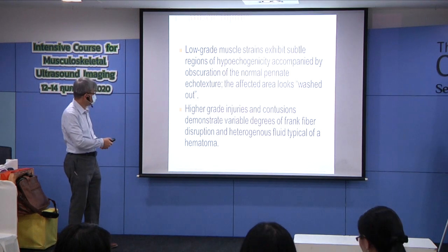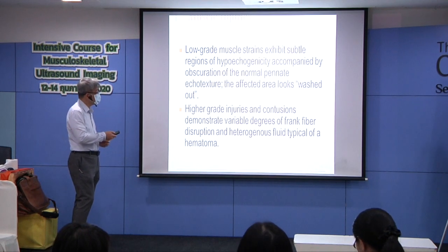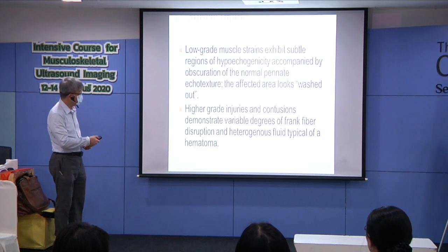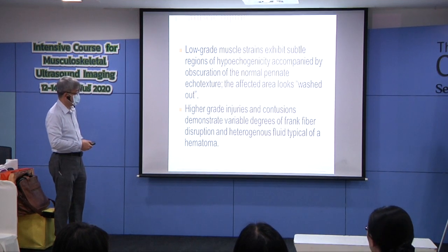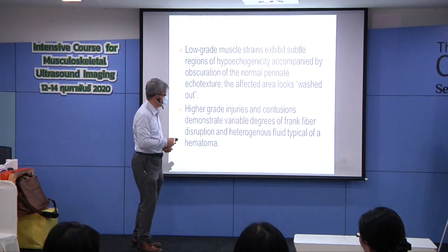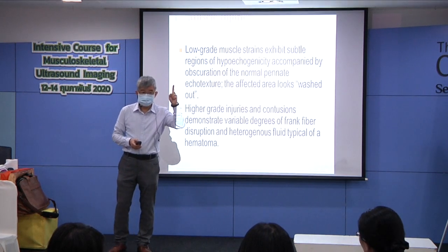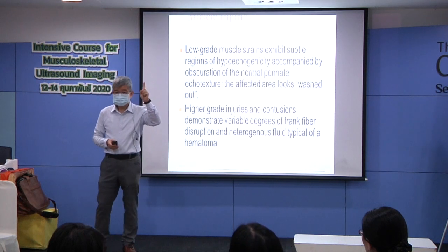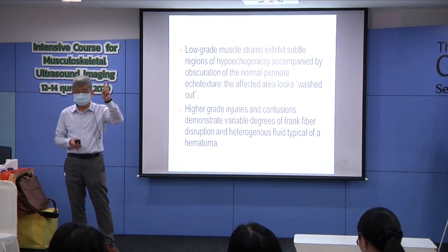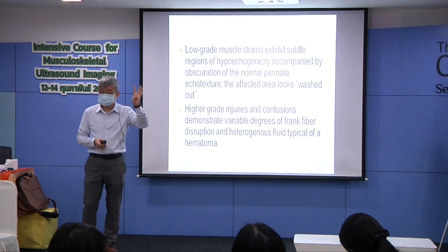Okay, so low-grade muscle injury may be difficult to find because the hypoechoic area may be very small, and the pennation probably does not become invisible. So if you would like to find the tiny muscle tear, do you want to: 1, reduce the dynamic range; 2, increase the dynamic range; 3, you don't know what dynamic range is; 4, you don't know what I'm asking.